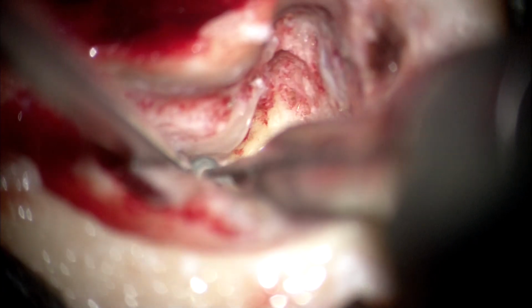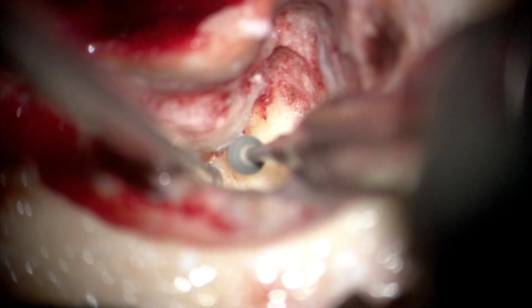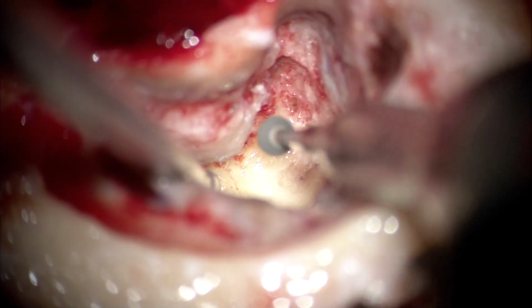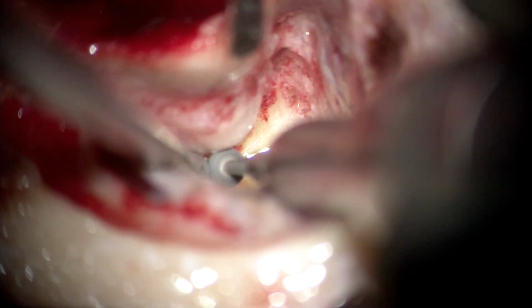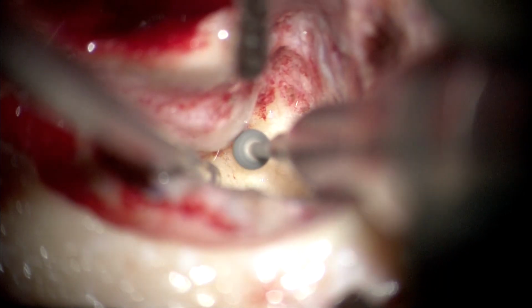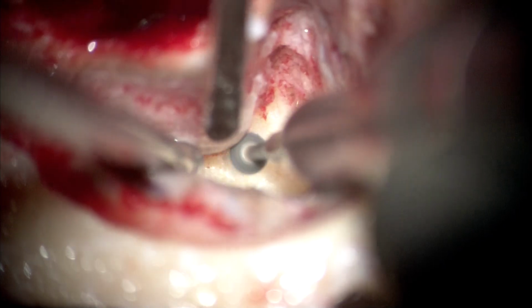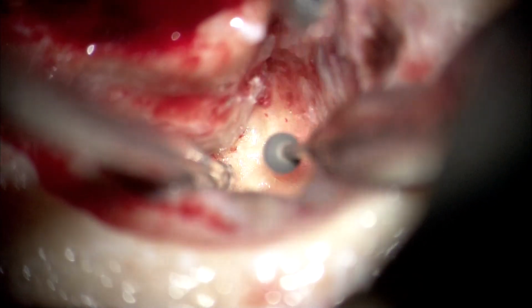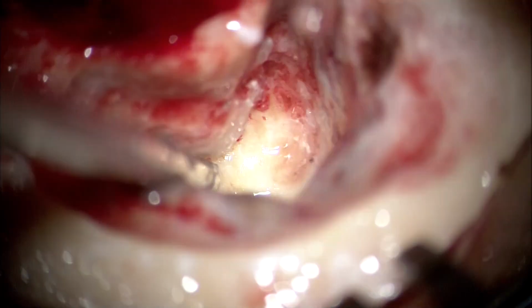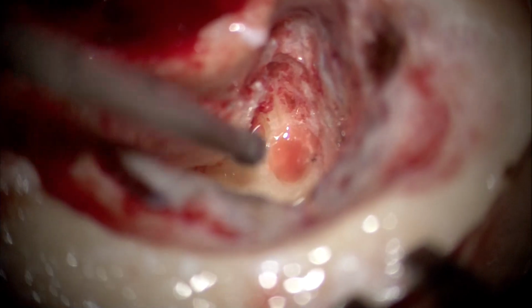Here we are using a medium to small sized diamond burr to gently increase our exposure inside the vestibule by drilling the lateral lip of the vestibule. This is of course done with a feather touch under constant irrigation with the drill in motion, so that we do not contact the facial nerve fibers. The small burr can be gently taken inside the vestibule as well to drill the bone and to clear any epithelium if that has been left from our angled picks or needles.